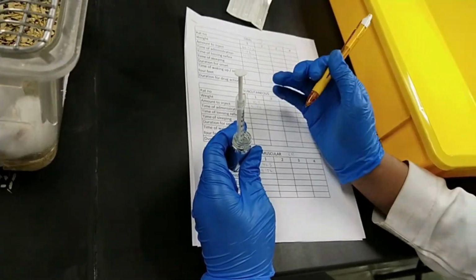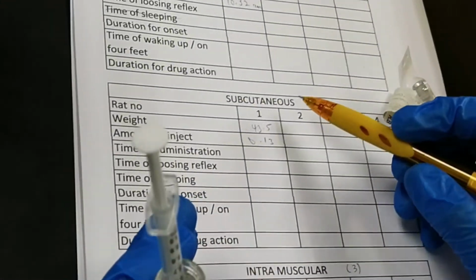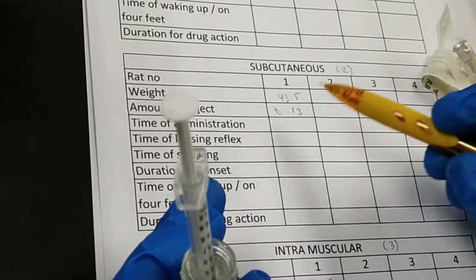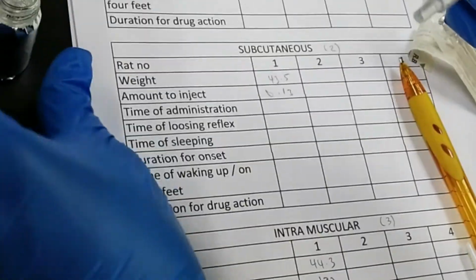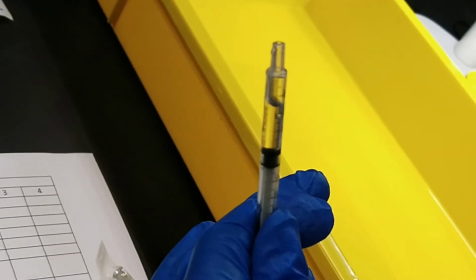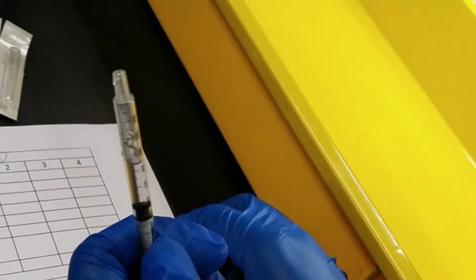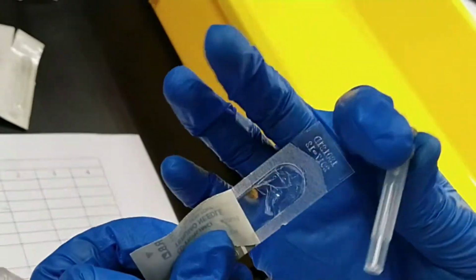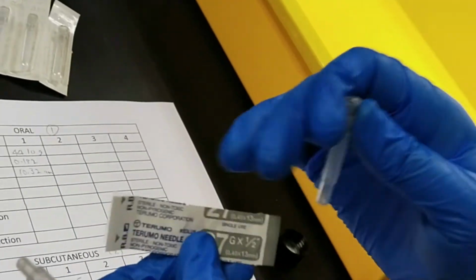So now we're going to proceed with the second injection, which is subcutaneous injection. So the volume needed for injection is around 0.13 ml, as you can see here. So we're going to fill up the drugs again into the syringe. Okay, and as usual, need to remove all the bubbles from the syringe, and then we're going to put on the needle. This is the needle that we're going to use for the injection. This one is a 27 gauge needle, as you can see here.